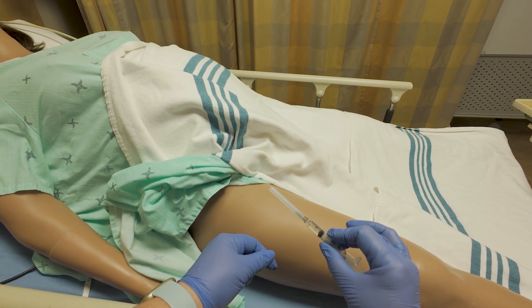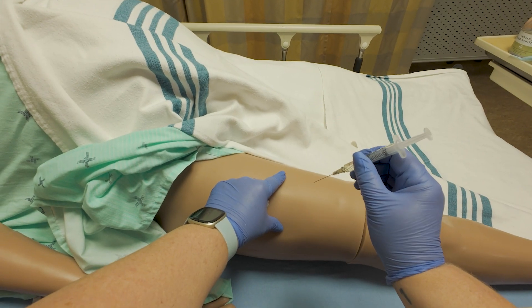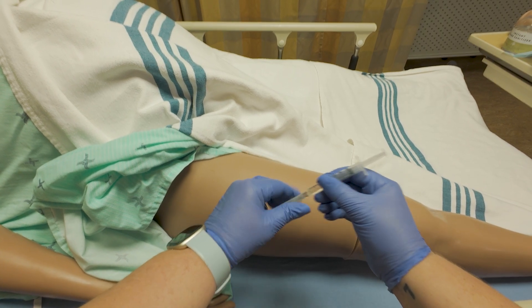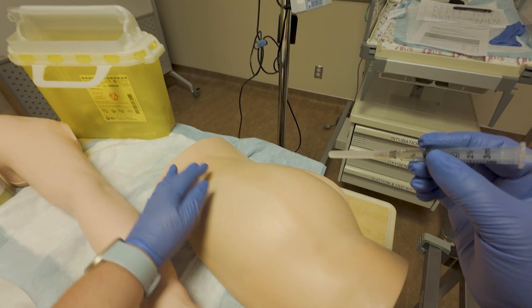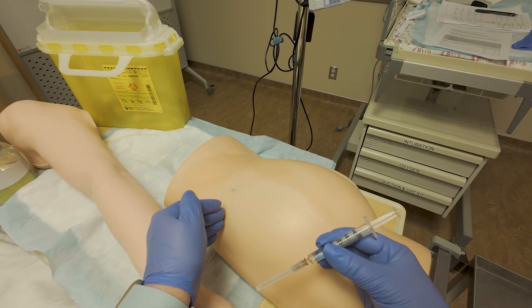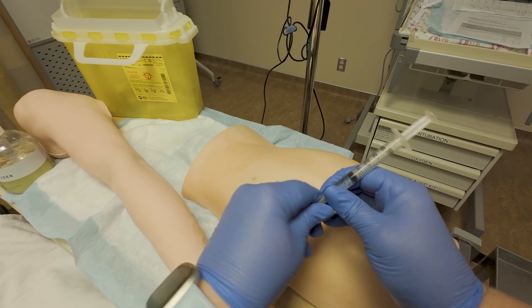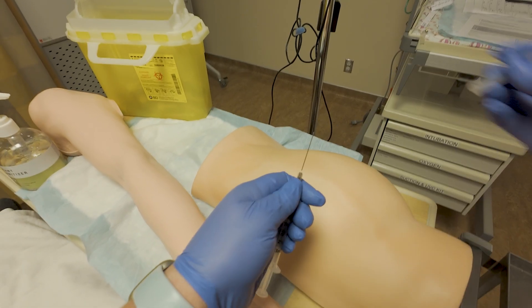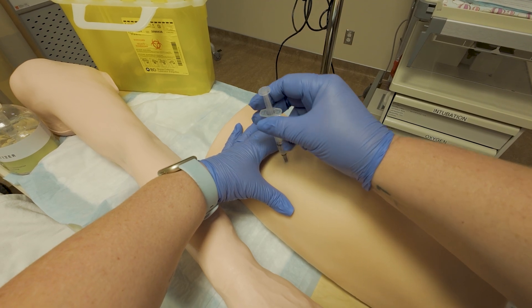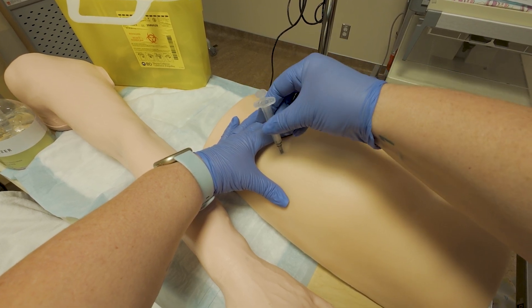Now we're going to take our syringe with medication and inject it into the space we have just cleaned at a 90-degree angle into the thigh. Because I can't inject into this person, I'm going to move over to our trainer and actually inject there — this would be a ventral gluteal injection for demonstration purposes. We've cleaned our site, we've landmarked, and we're going to inject. We warn our patient: one, two, three — poke — at a 90-degree angle. Withdraw very slightly to ensure we're not in a vessel, inject our medication, then remove the needle at a 90-degree angle. The intramuscular injection is now complete.